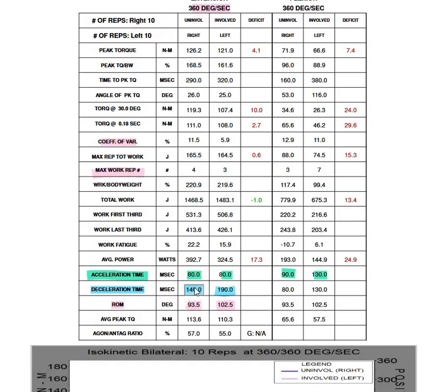Again, we take this with a pinch of salt, because even if we constantly move at a constant angular velocity throughout the test, when we reach the end of the movement, obviously you can't go any further anyway because you've preset the range of motion. So it's not an amazing indicator of eccentric function of the antagonist, and we could just test that anyway by performing an eccentric test.